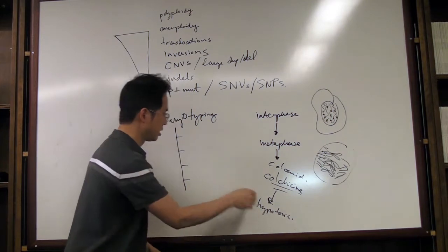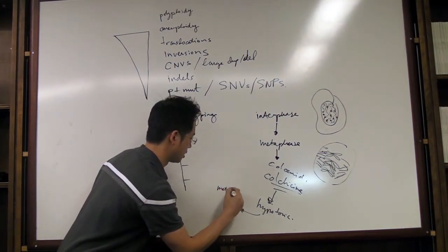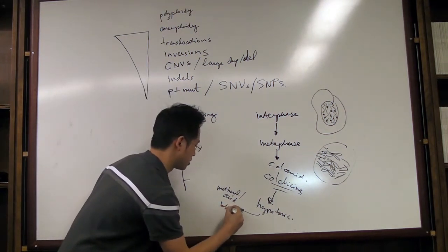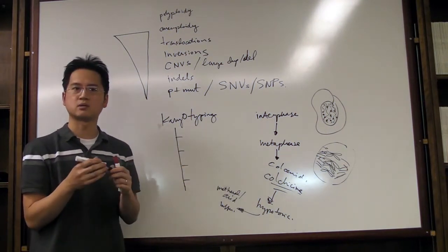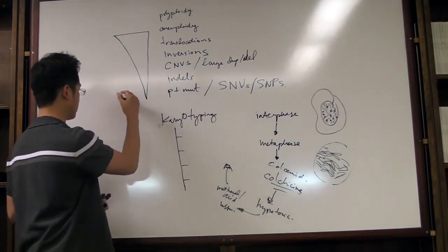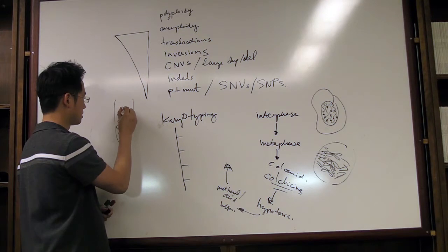And the next step that you would do in terms of performing the karyotyping process is you will need to fix it. So you'll fix it in some methanol acetic acid. I think it's like 3:1 or something is the ratio. Methanol acetic acid buffer. And this basically preserves the cell. First of all, it kills the cell, but it also preserves the DNA and all of that so that it's nicely fixed for you. So the next thing is you would actually take these cells. So essentially now you have a suspension. It could be in a test tube. So here's the hypotonic swelled up cells with the metaphases inside.